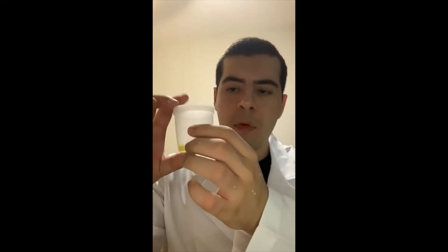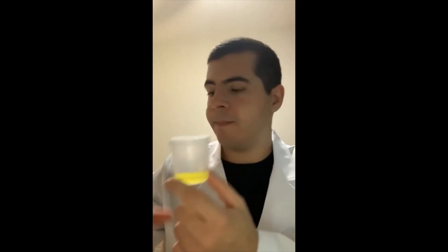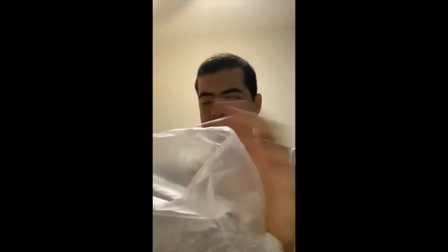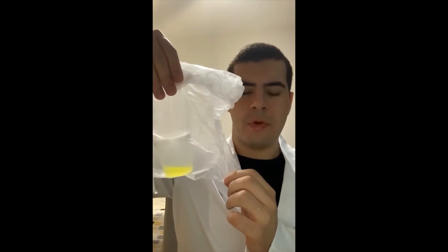We should try not to contaminate the genital area and the specimen. After catching the specimen, we will wash the external area of the container, then with the help of a plastic bag, we will place our specimen inside and send it to the laboratory for examination.